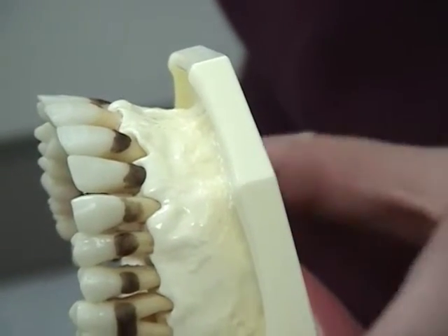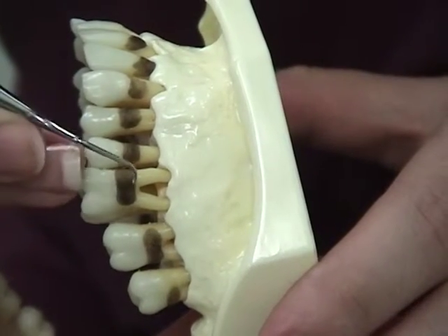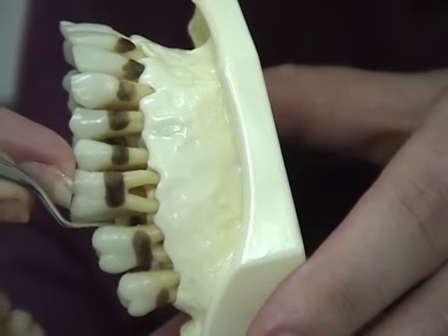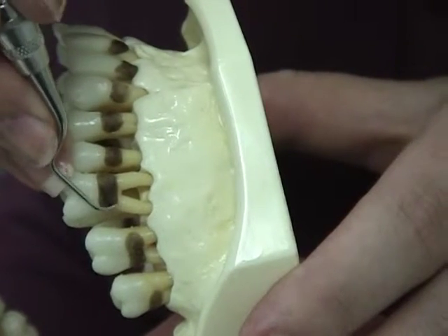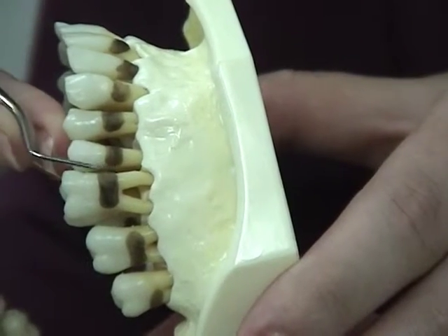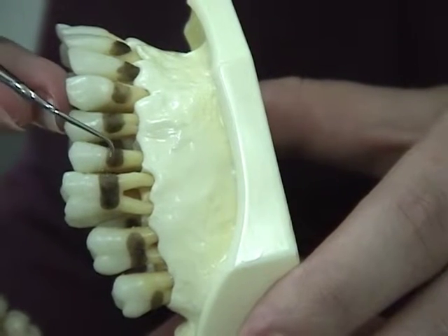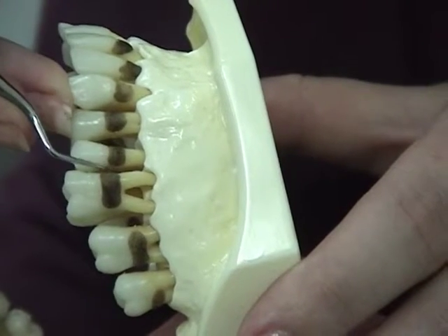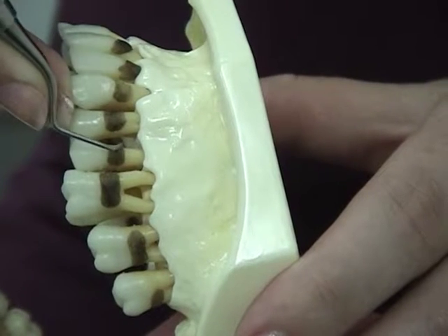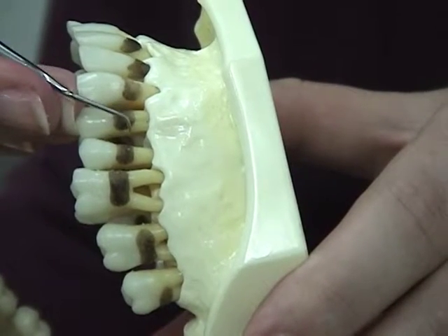For posterior teeth, you will be adapting the instrument from the distal facial line angle to the distal contact, and then from the distal facial line angle across the facial surfaces through the mesial contact. Notice how she keeps the last two millimeters of the instrument in contact with the tooth at all times. This technique is the same for both lingual and facial surfaces of posterior teeth.